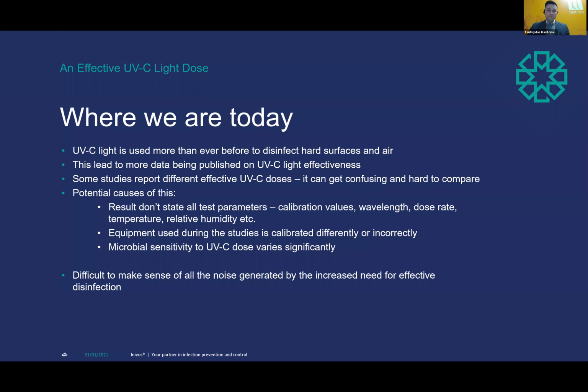Now, the second group of systems try to state an efficacy, dose or time, etc. Some of the systems try to do as little as possible, or choose a single organism and claim an effective dose on that specific organism, which in this case is whatever is in the current challenge.